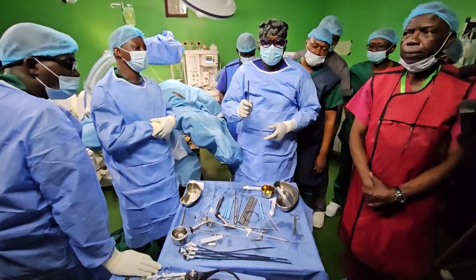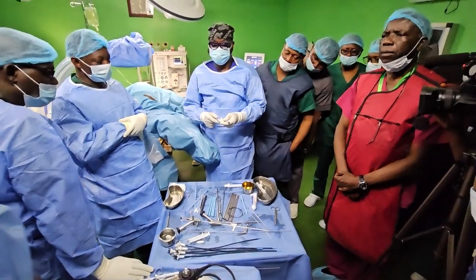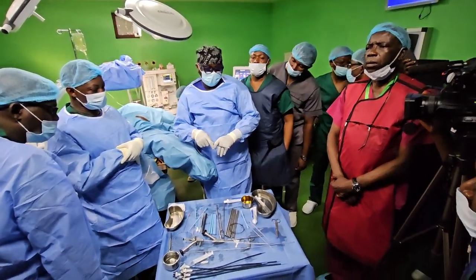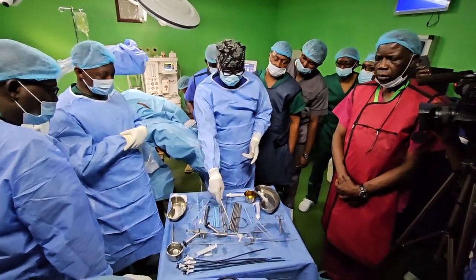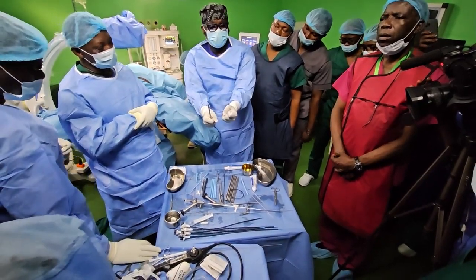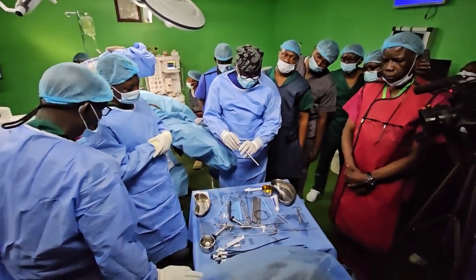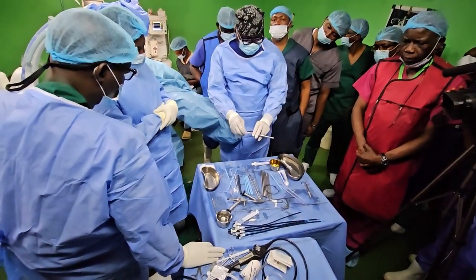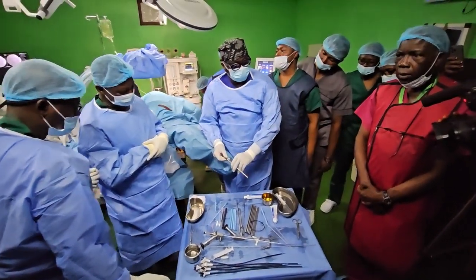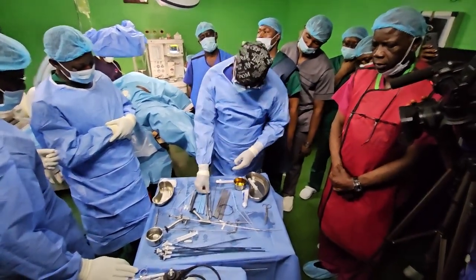Let me tell you the benefit of the metallic dilatation. In my presentation tomorrow, I will show you how I broke my mini nephroscope, completely bent like this. And that's about $7,000. When the metallic sheath is in, if you need to torque, it helps you torque and protects the scope. So that's the benefit of metallic. Since I don't have it, that's why I use all of this. But if you have metallic, I think metallic is it.